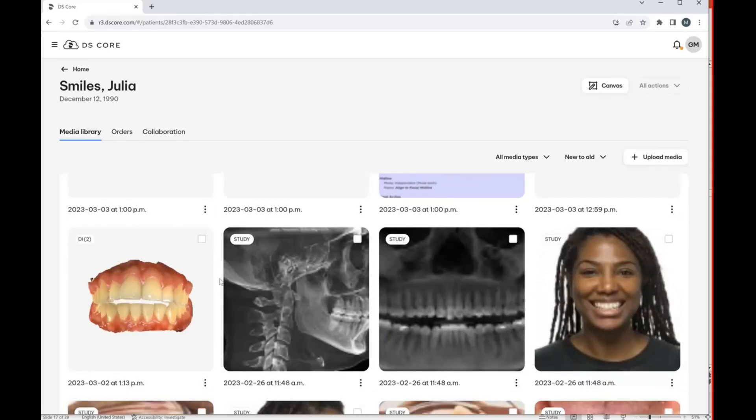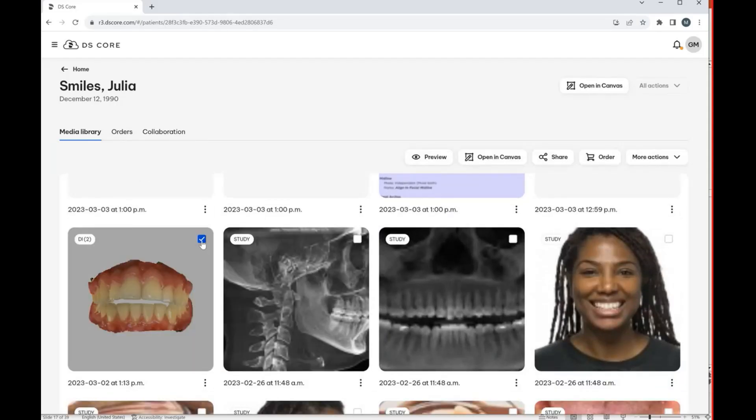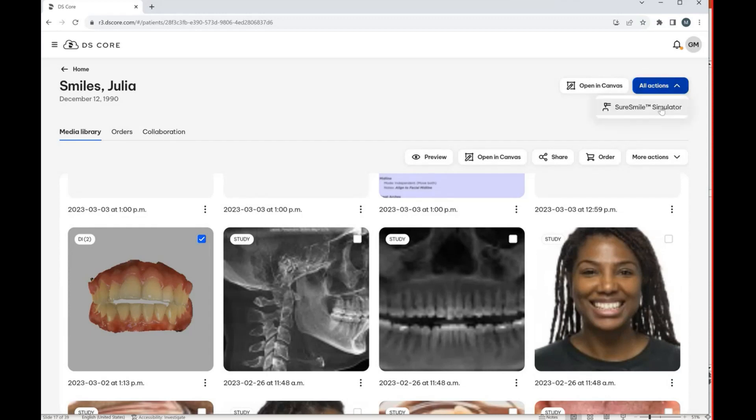So when you come into your DSCore platform and you have your patient open, you're able to essentially open their scan right away. And you'll see this tab now on the upper right that says All Actions.